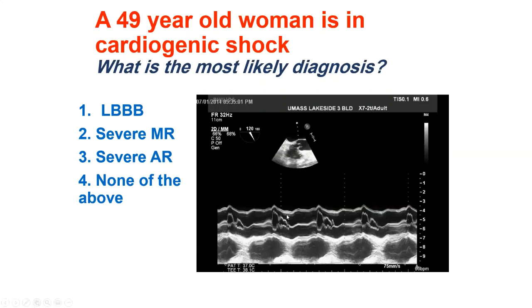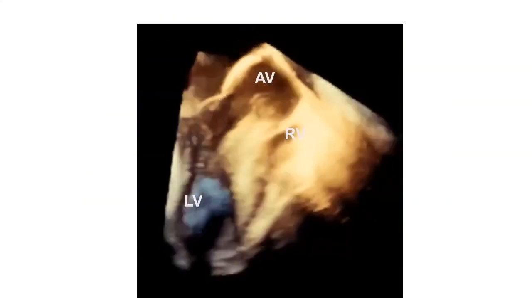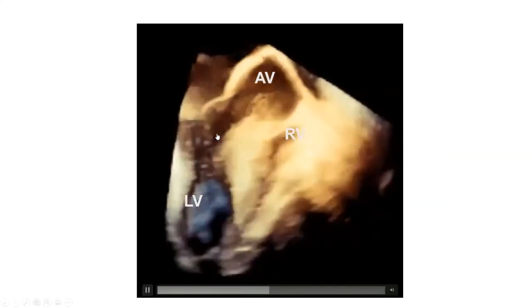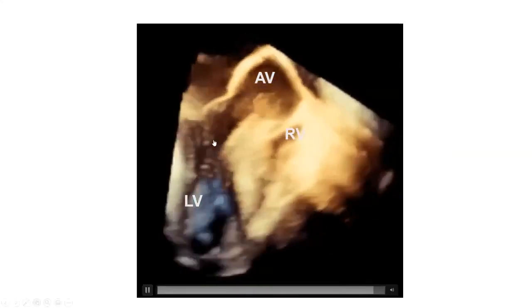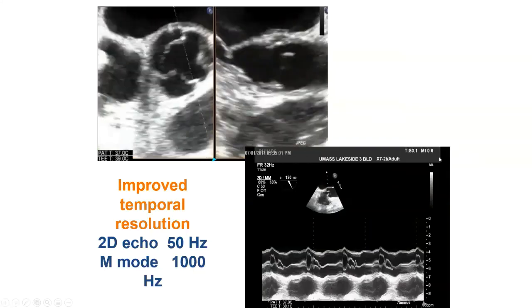Ask you to take a look at this envelope. I think you would agree this is very different than the normal aortic valve envelope that has that nice parallelogram shape. And here is three-dimensional echo on the same patient showing this person actually had an acute stress cardiomyopathy. You can actually get a hint of that from this three-dimensional echo, and you should certainly be able to see the systolic anterior motion of the mitral valve causing intermittent obstruction.